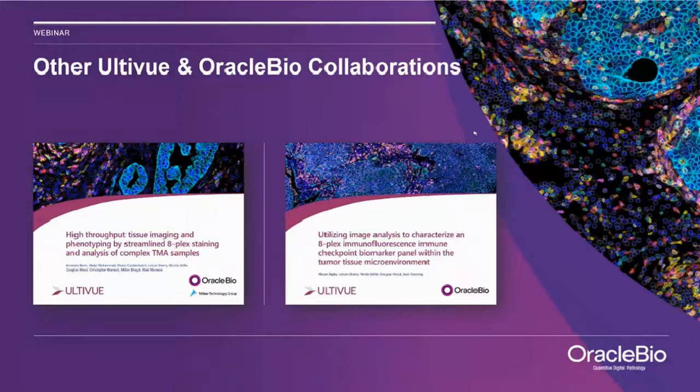Okay, and how do you determine thresholds in the algorithm? How do you determine thresholds in the algorithm for positive marker staining? Yes, I think we got a question like that as well, just a few back. So again, it's working with a visual QC across a range of images, and then getting that validated by the pathologist.